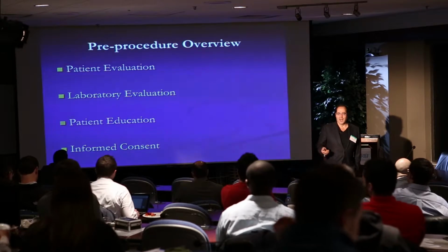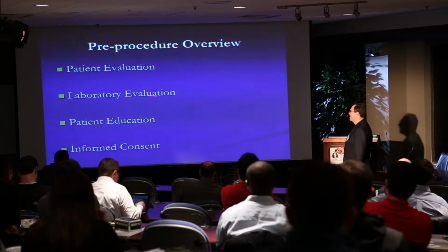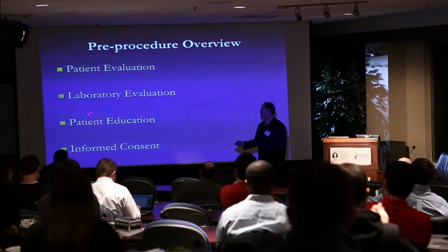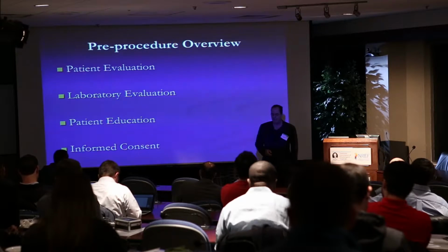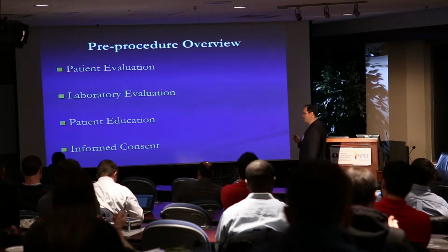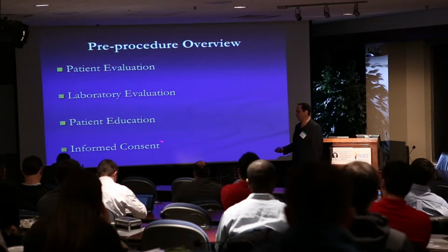Prior to doing any angiography, just like any operation, the basics consist of a patient evaluation, obviously a glance through the patient's laboratories. Patient education, maybe you do this in your office, but in patients that are transferred in, either the family or the patient themselves really need to understand why you're doing this. This is an invasive procedure. Even though it may take you only 15 minutes to do, it's important that the patient understand why it's being done and that you obtain informed consent.